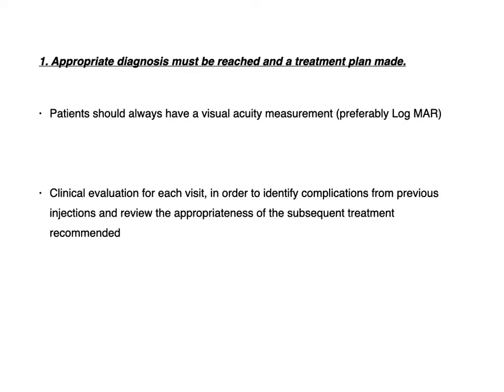Intravitreal injection way of treatment entails crucial steps before entering the injection room. First, clear diagnosis and injection protocol are clearly explained to the patient. Also, the possibility of frequent injections, recurrences after improvement, and expected prognosis have to be discussed neatly, and ensure that the patient is well informed.